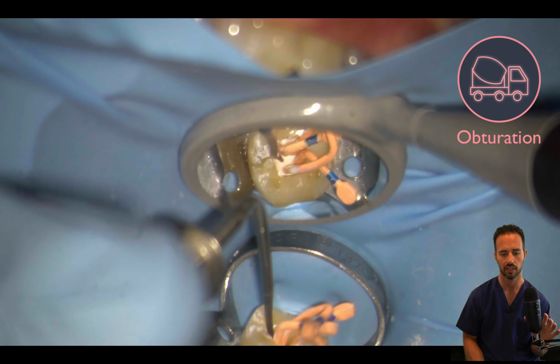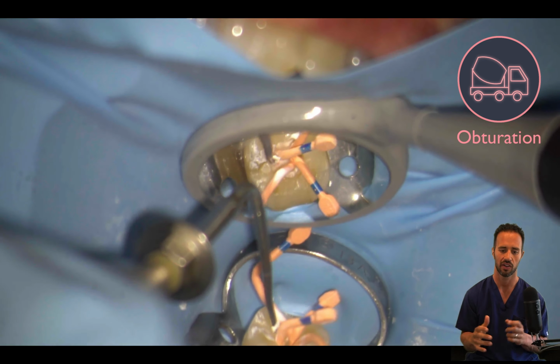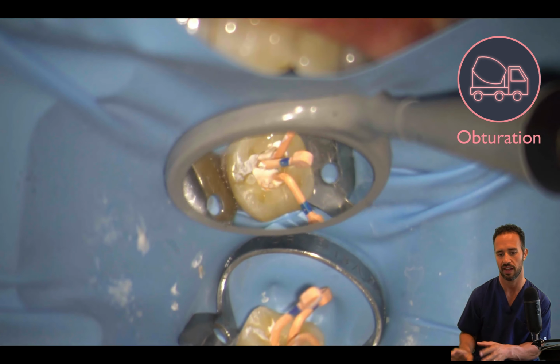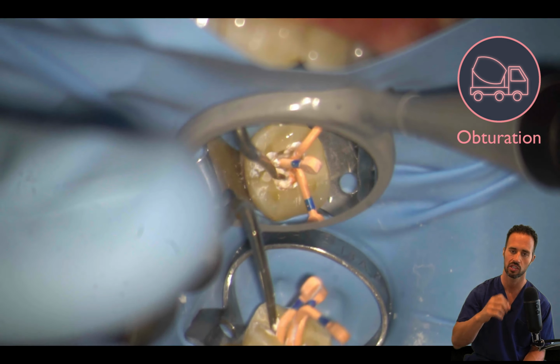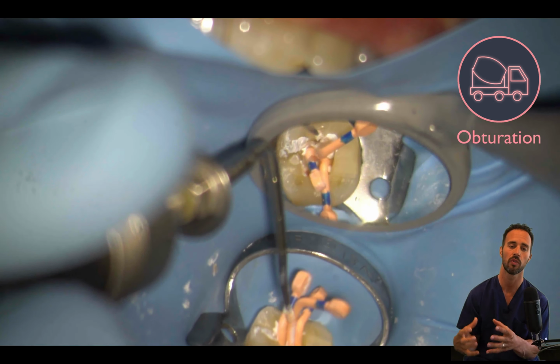So it can get a little bit busy inside the access preparation here, okay? So you want to be careful that you don't accidentally pull out a cone from an adjacent canal. So, start wherever you have easy access and remove that cone, and then slowly, as you sever the cones, you'll have more room to work with.